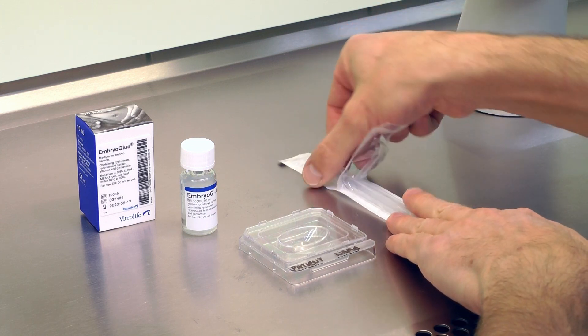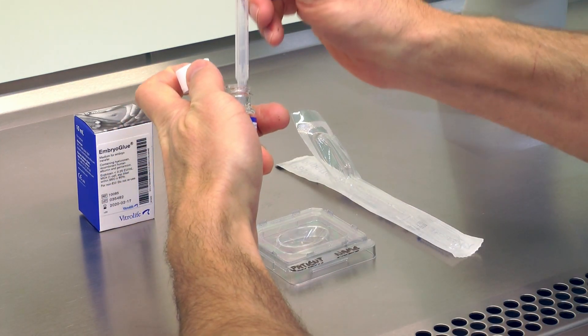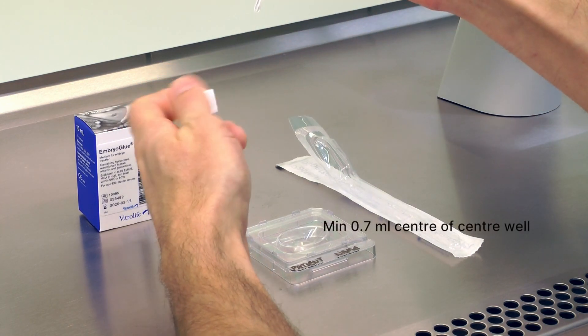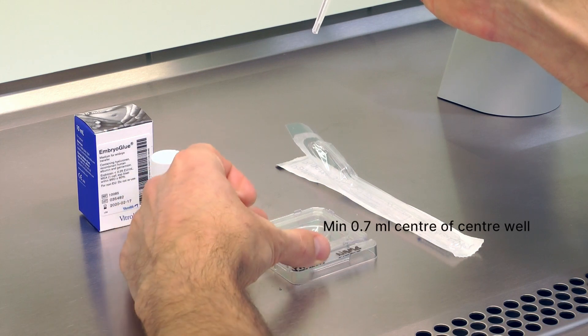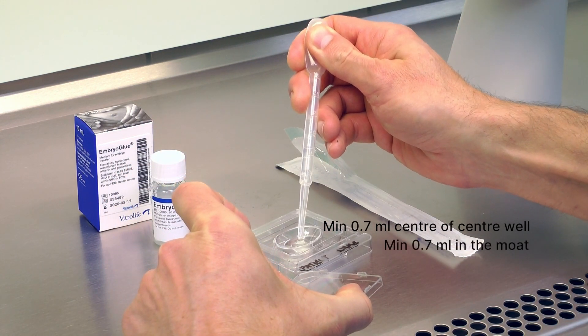To prepare an embryo transfer dish with Embryo Glue, aliquot a minimum of 0.7 ml of Embryo Glue in the center of a center well dish and at least 0.7 ml of Embryo Glue in the moat of the center well dish.